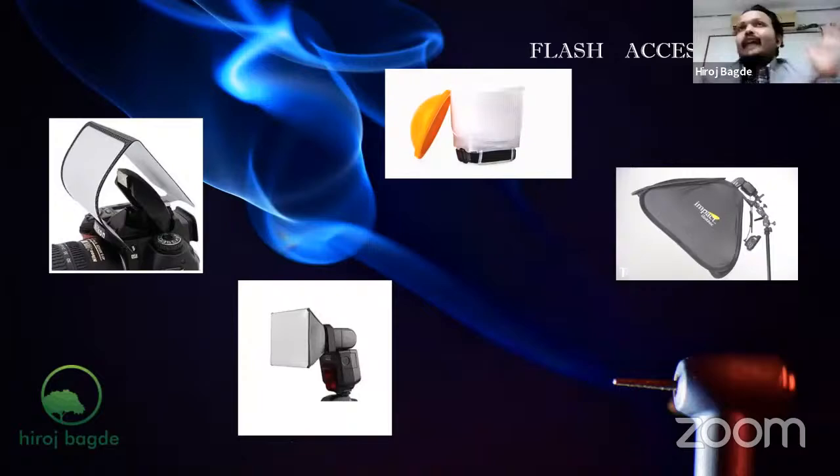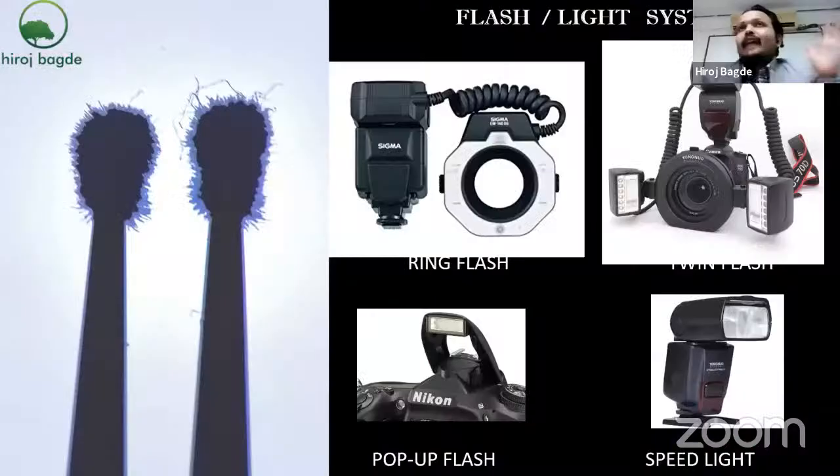Now, third and fourth, these are the two important things which are very much practiced whenever it comes to dental photography. The third and fourth, I'll show you one part of it, something called a ring. Can you see a ring? And this can be attached to the DSLR.